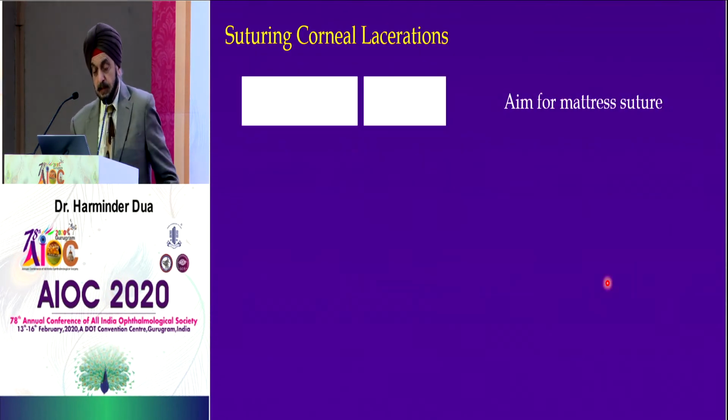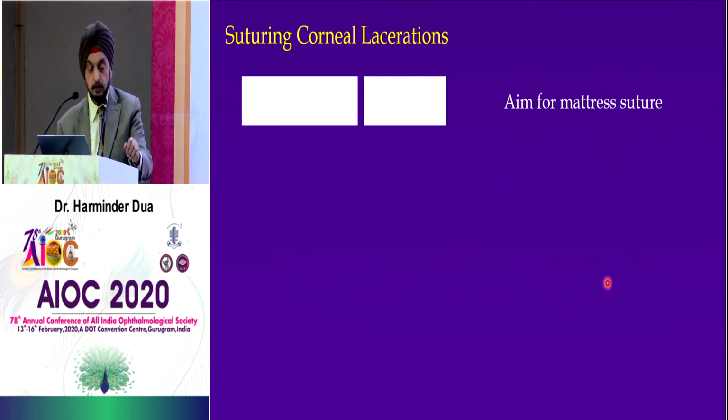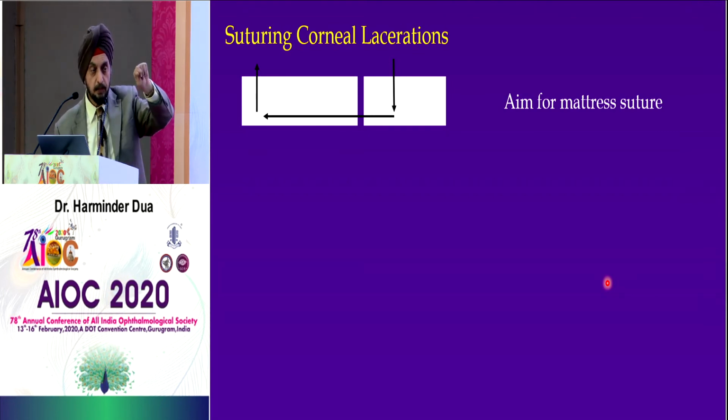Now, looking at the depth of the wound, how far will you go? So if you go like that, 80% of the depth, then along and like that. Now it's very difficult to get right angles in the passage of your needle because it's a curved needle, but you go vertically straight down, turn it round, move along, and don't start directing it towards the surface right as you start. Move it along flat and then turn it up, and you will get this mattress effect.